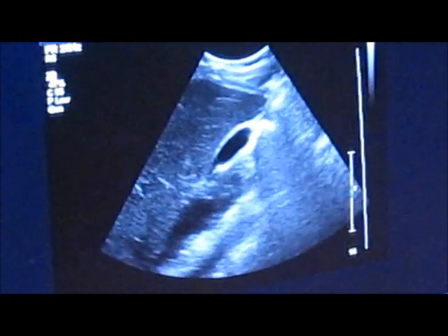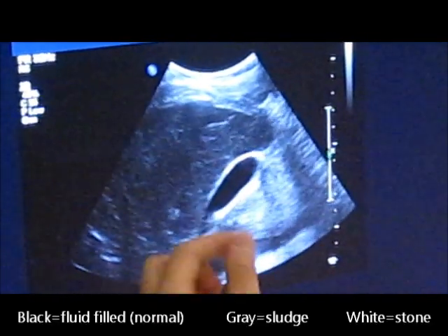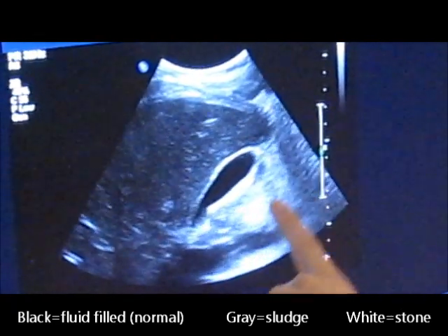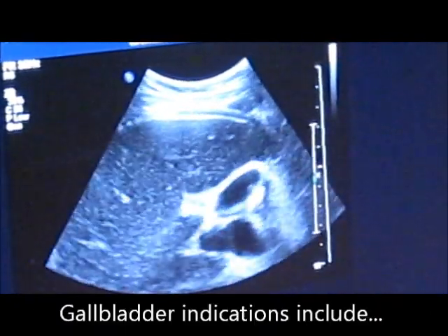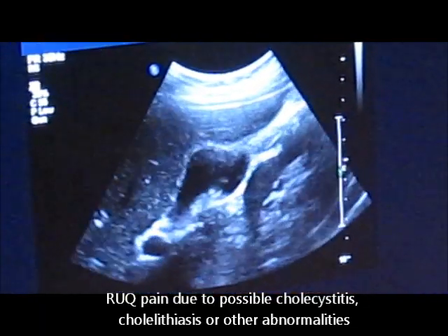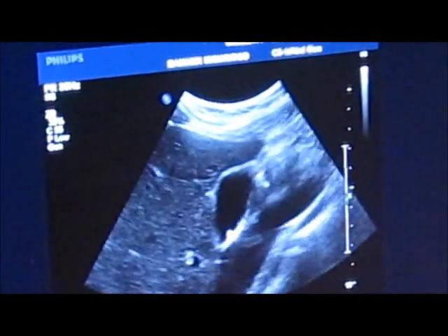And then the biggest culprit of pain in the belly would be the gallbladder. It's also a fluid-filled structure. It's filled with bile, so it's going to be this black area here. If they happen to have stones, you're going to see bright white shadow structures within the gallbladder itself. If they have sludge, which is like thick bile, it's going to look more gray, like this color here, but within the gallbladder itself. So this is one of the really common reasons we do abdomen ultrasounds, for pain and possible gallbladder stones. But this is a normal appearing gallbladder. There's nothing in it. Just nice and black all inside.